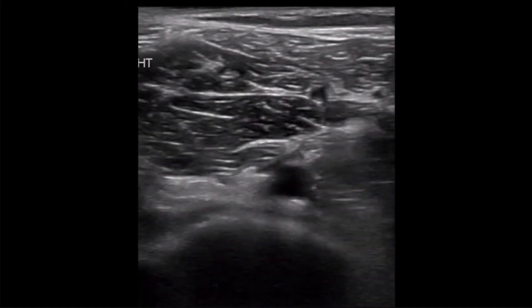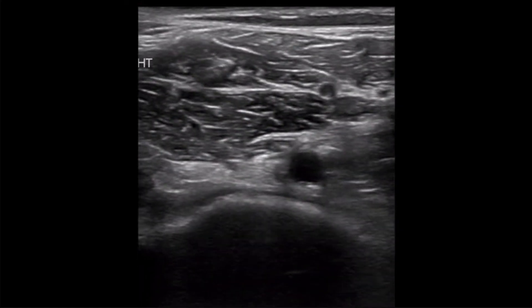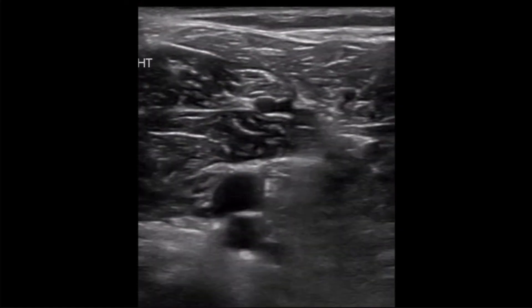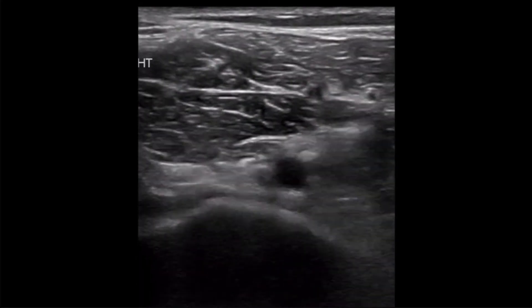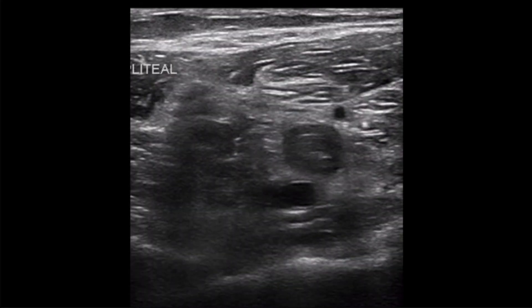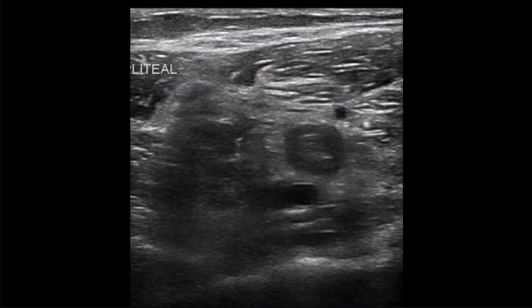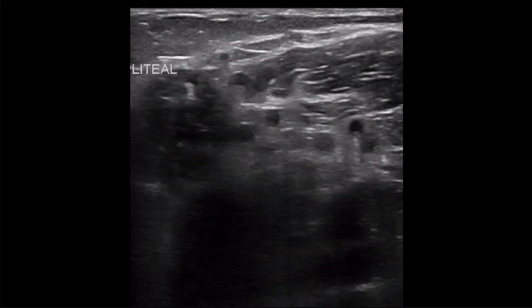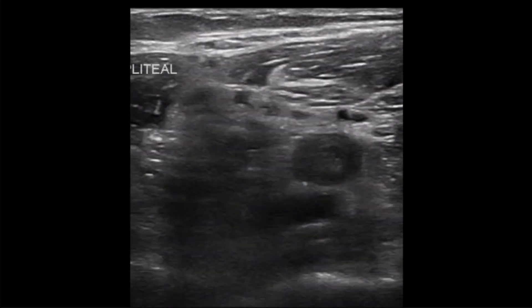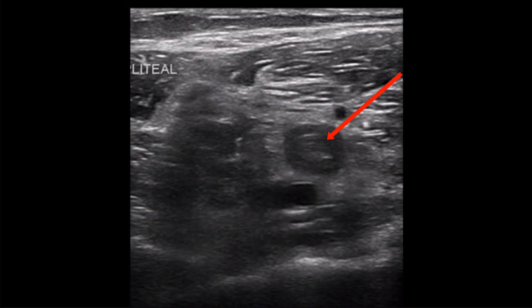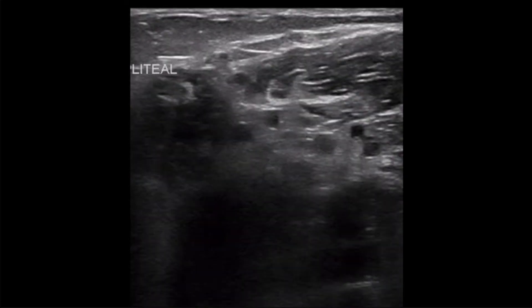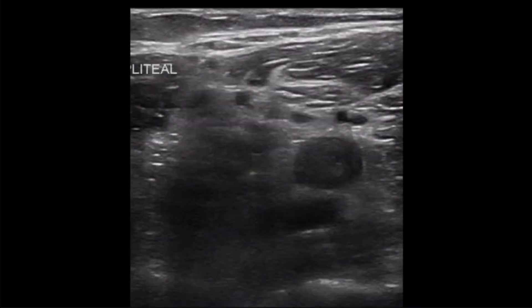Here's another clip above the level of the trifurcation showing the compressibility of the popliteal vein sitting superficial to the artery. And finally, an example showing a DVT in the popliteal vein with not only incompressibility, but also echogenic material within the lumen.